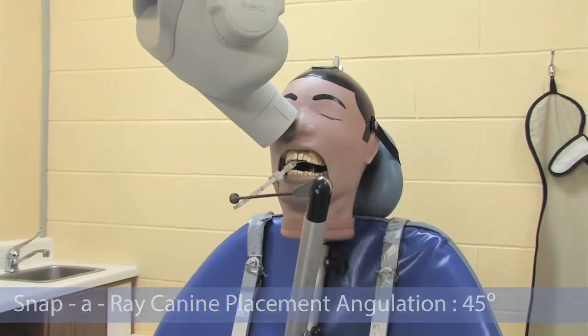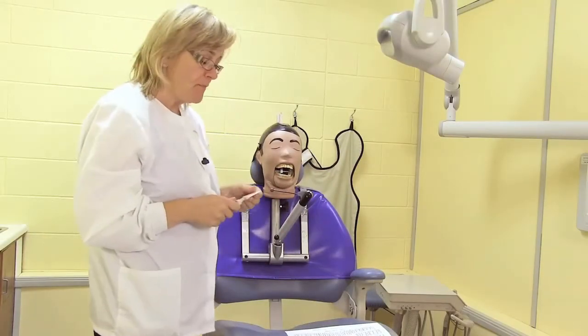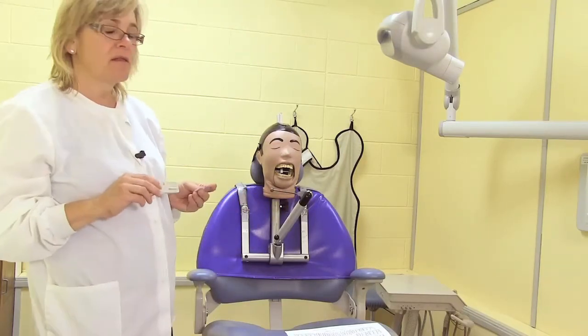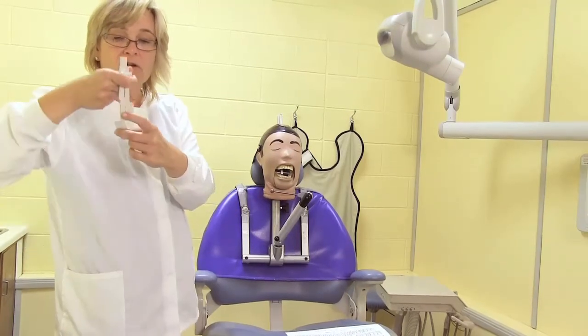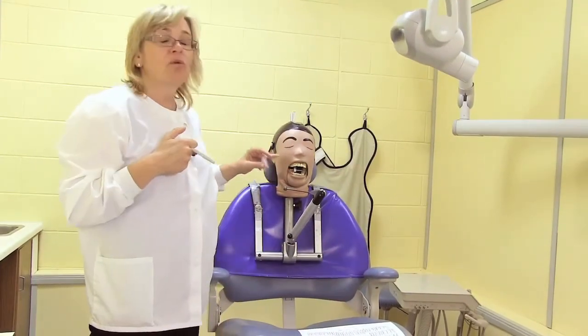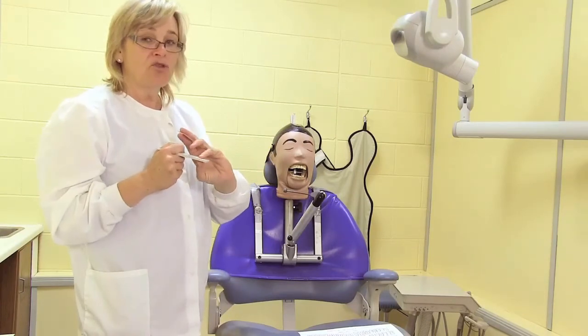So that's just a quick synopsis of the anterior shots. Now I'll do the premolar shot. For the premolar and molar shots, we only use the snap array instrument. Always remember that the larger portion of the snap array goes towards the buccal surface, simply because that's where the bite, or the occlusion, should occur.